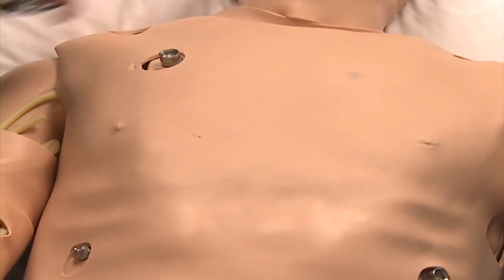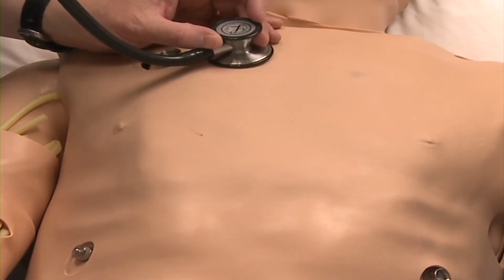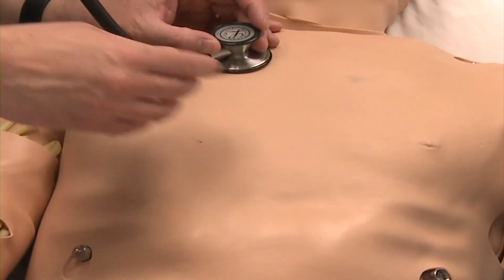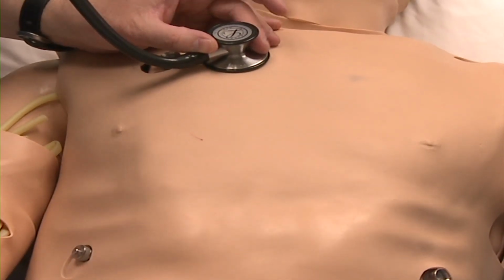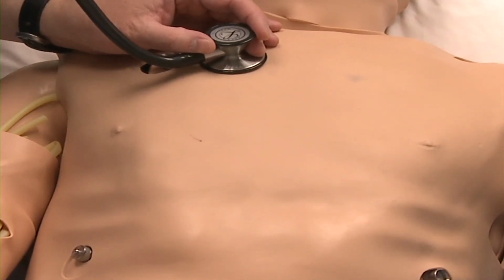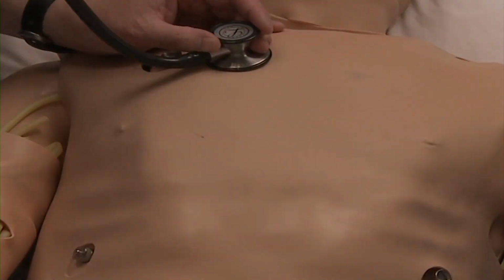Therefore, it's very important that as you auscultate the chest, you make sure you're over the speaker and you distinguish the sounds coming from the speaker from the sounds created by the chest moving. If you're troubled by this and can't auscultate the breath sounds clearly, please say so out loud so that the people in the control room will know you're having difficulty.